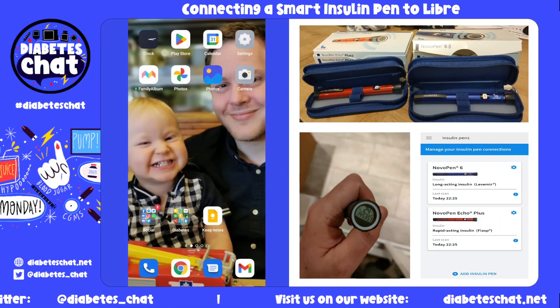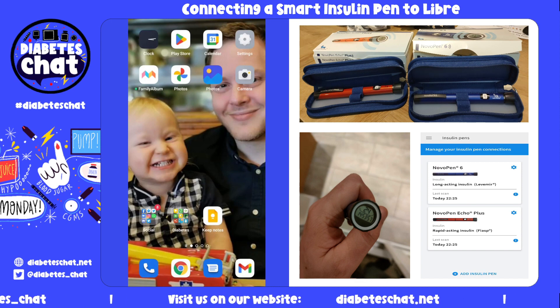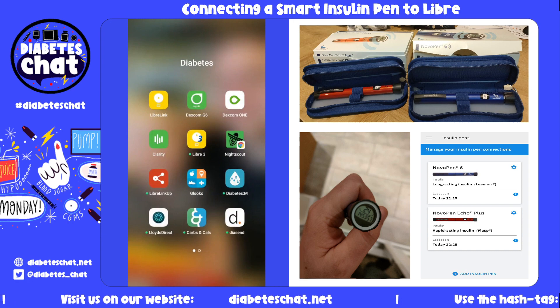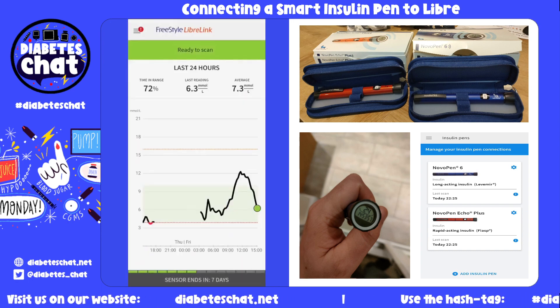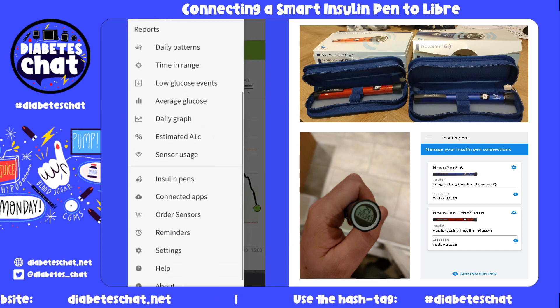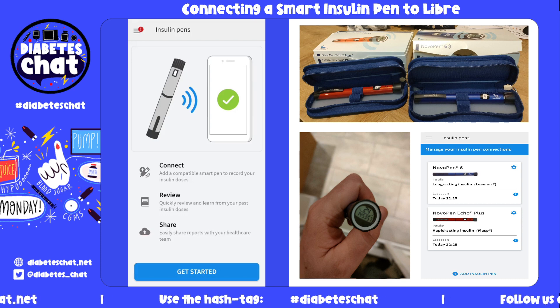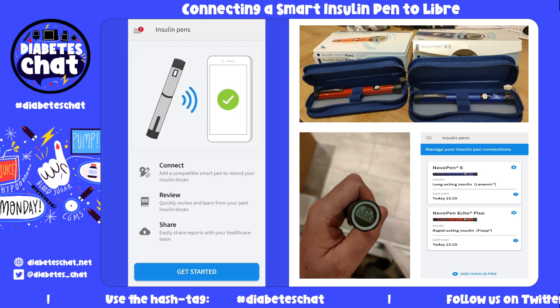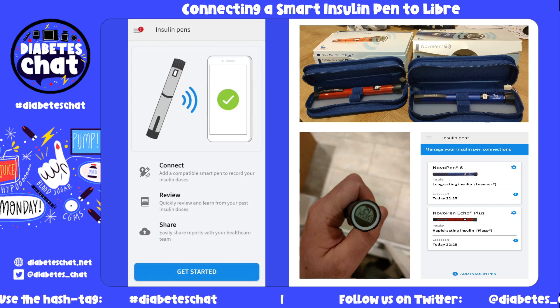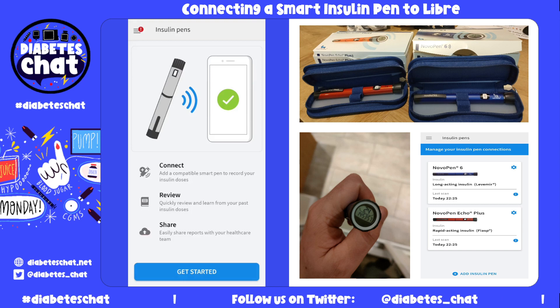Hi guys. I've seen on Twitter today that you can now link up your Novo Pen Smart Insulin Pens to LibreLink. I'm going to show you how LibreLink works — click on the menu tab, scroll down to Insulin Pens. You'll see this new cool interface so you can connect your compatible smart pen, review all past recordings, and share with your healthcare team.